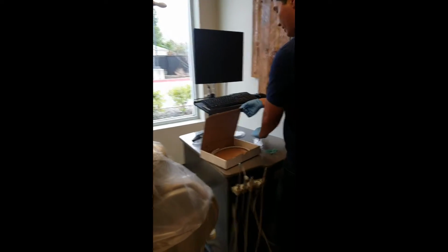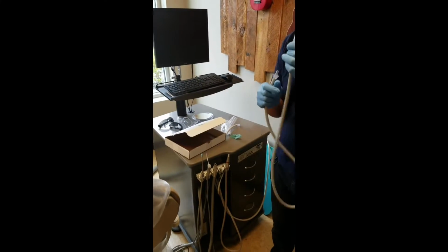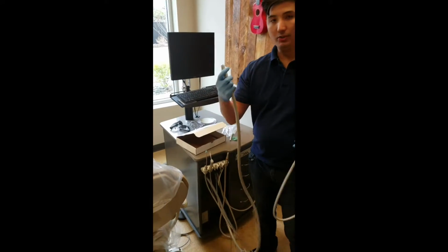So let's see here. So here's that hose. We have the HVE adapter, and this just pretty much goes on any HVE unit valve right here.